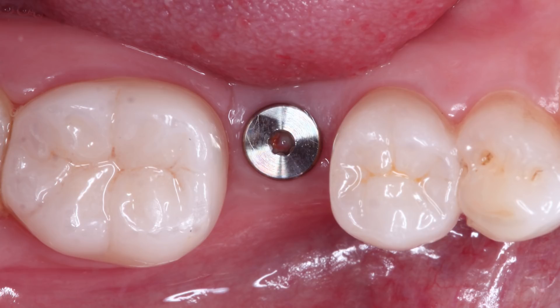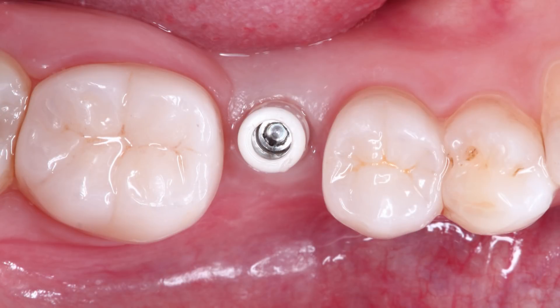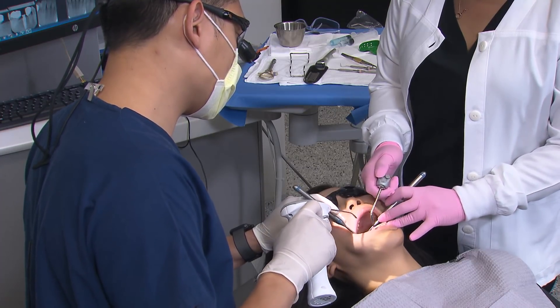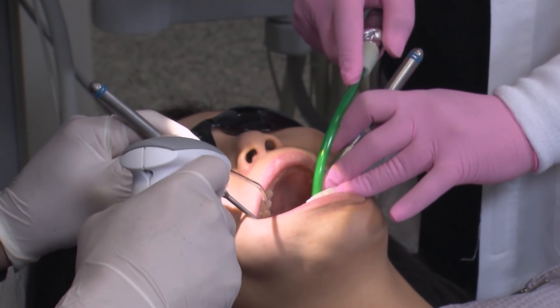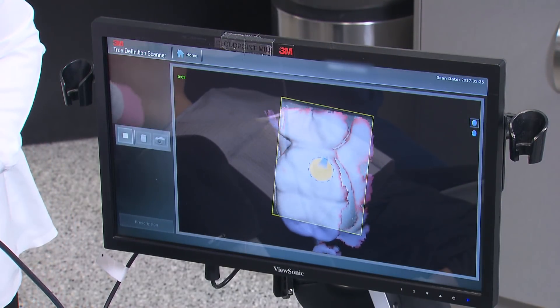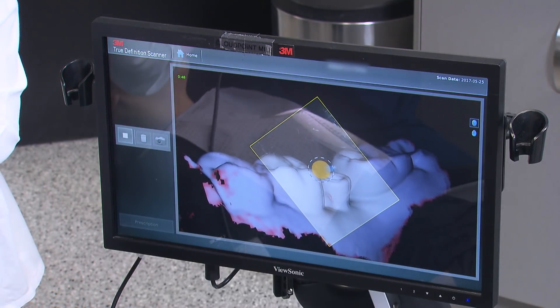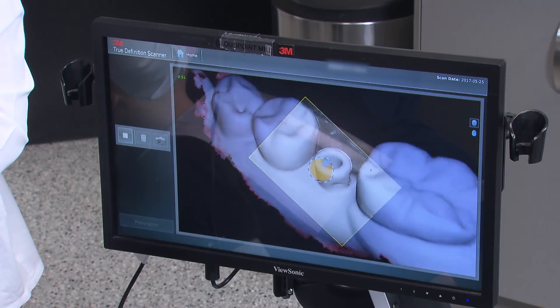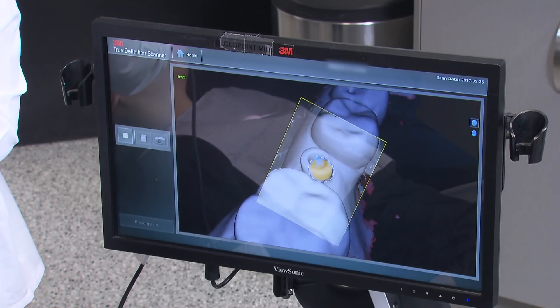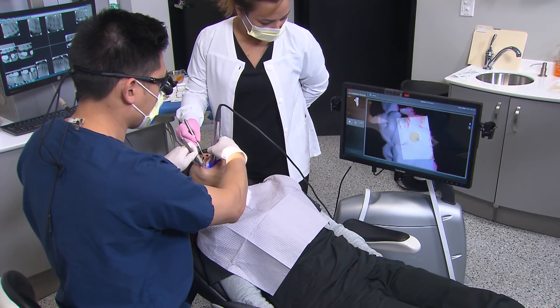After four months of healing, it's time to take the impression for the final restoration. I remove the healing abutment and place the scan body, since I will capture the impression digitally using 3M's True Definition scanner. I apply a thin layer of contrast agent to the abutment and surrounding tissues for the scanner to acquire the interocclusal information needed to fabricate the restoration. As I move the scanner around the area, I watch the screen as the system provides instant feedback while I capture the occlusal, buccal, and lingual surfaces. All digital impressions act like a digital triple tray, requiring a scan of the prep area, opposing dentition, and bite so the lab can establish the proper occlusion for the restoration.